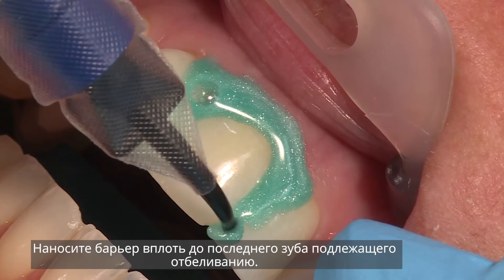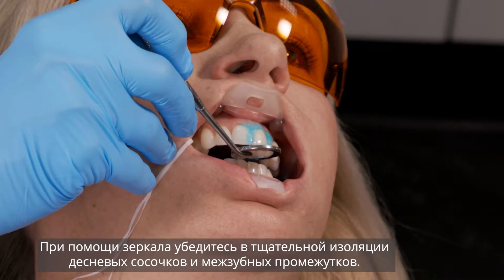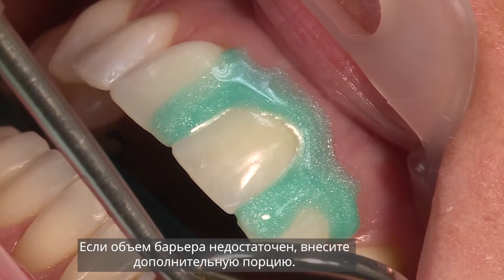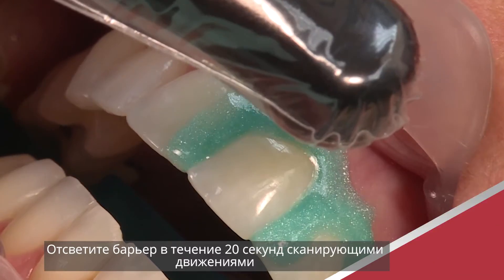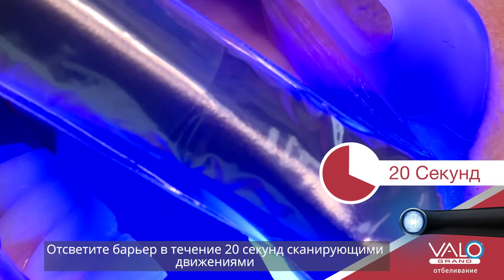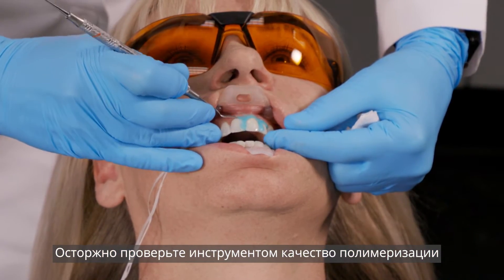Extend the resin one tooth beyond the last tooth to be whitened. Using the mouth mirror, look up the long axis of the teeth for gaps or minute openings exposing underlying tissue and reapply resin. Light cure the resin for 20 seconds using a scanning motion. Carefully check the resin cure with an instrument.